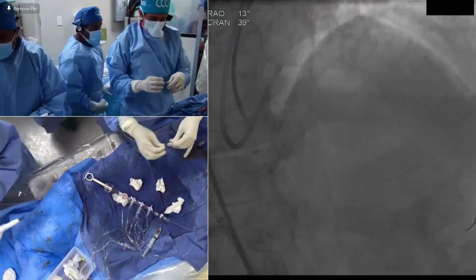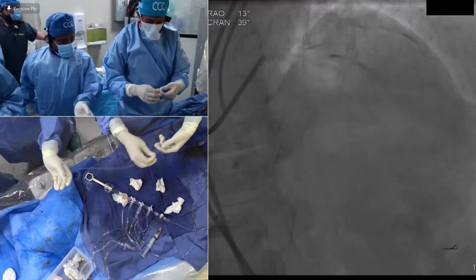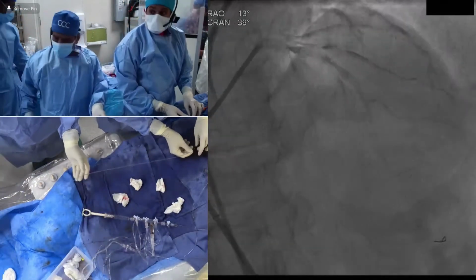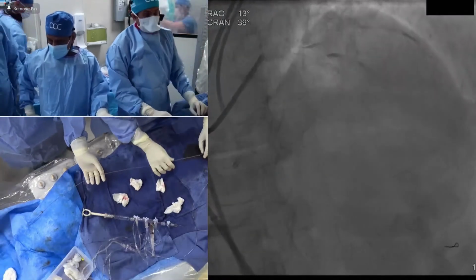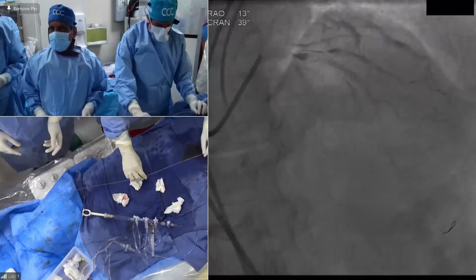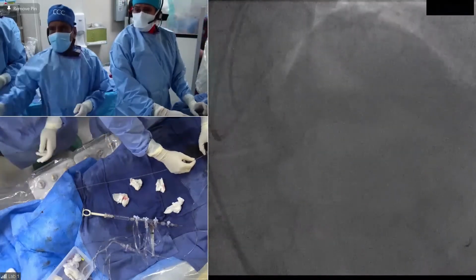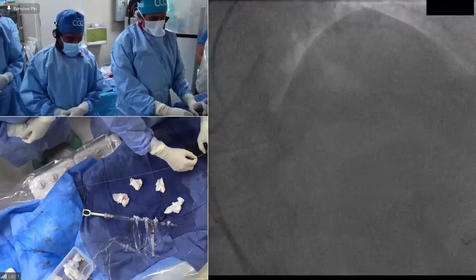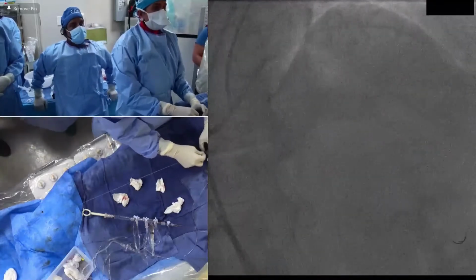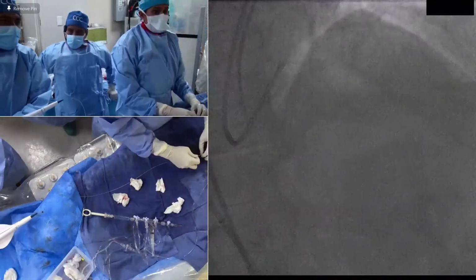Yeah, just to piggyback on that, CTOs. Let's focus on the rotablator. Yeah, forget about the CTO. I think if you're comfortable and you've been an experienced rotablator operator, you know which cases not to try without surgical backup. I think the bifurcation is definitely doable in a non-surgical on-site center. The CTO would definitely preclude you from doing this case, even though it's a short, straight segment, and that's why the wire went across so easily with the Fine Cross. But this would not be the patient that you would do offsite.